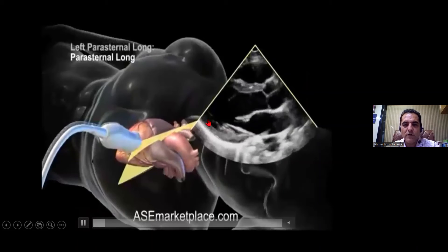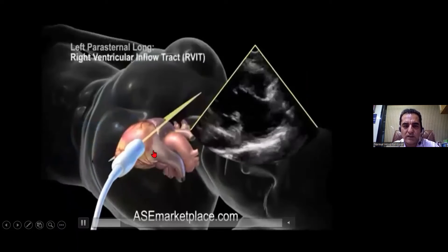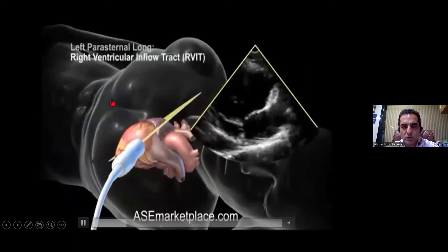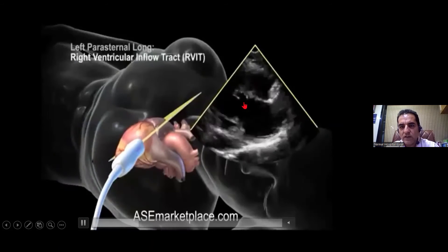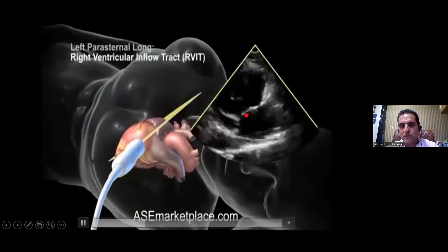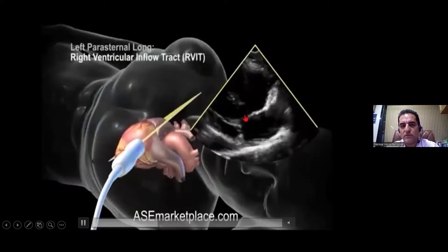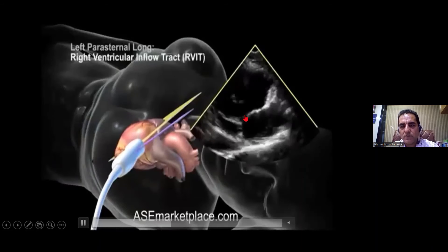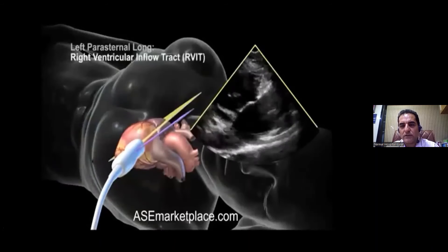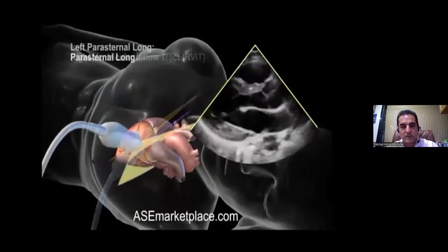Now we will do two sweeps. First, you can see the probe is being swept downwards towards the foot — we call it the tricuspid valve sweep, because you start seeing the tricuspid valve. That is the tricuspid valve sweep in the parasternal long axis view.